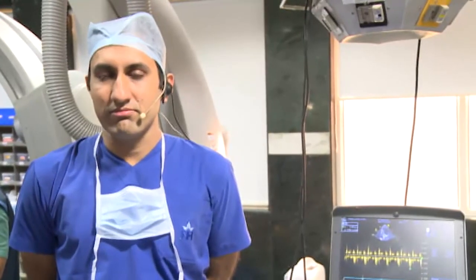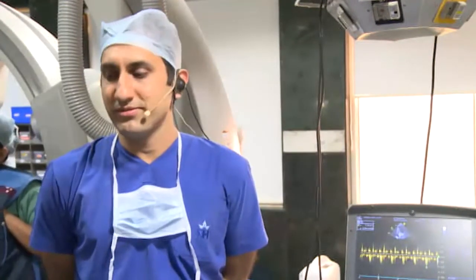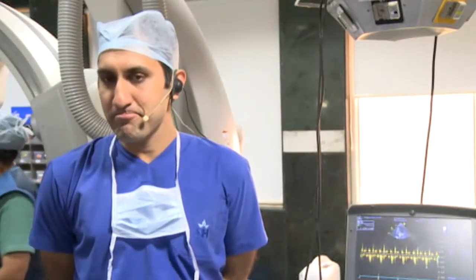If any questions, anything from your side, Dr. Parikh. So echo shows good functioning of the transcatheter valve, no AI, mean gradients in single digits, and the vascular repair process is ongoing there. We have 2 vascular surgeons repairing the groin. So Dr. Rao, thank you very much for sharing this technically very challenging case and quite ill patient.